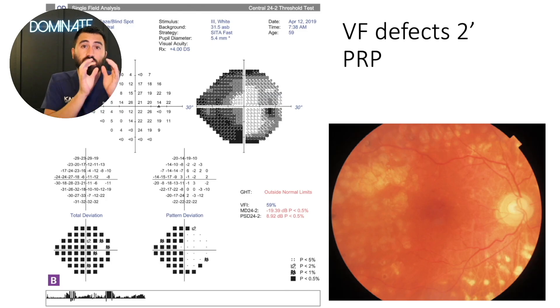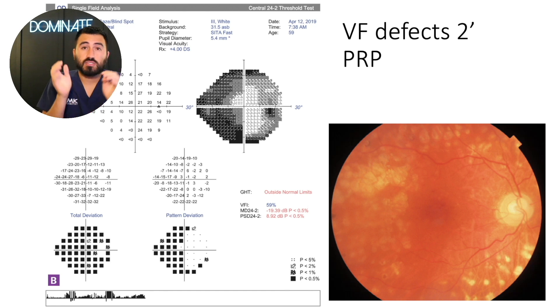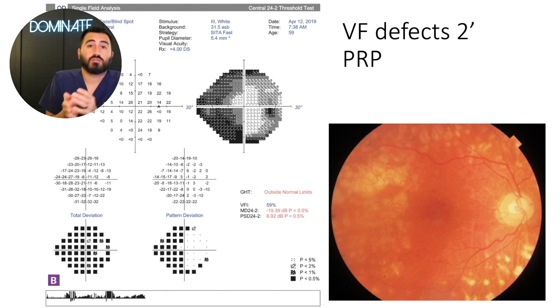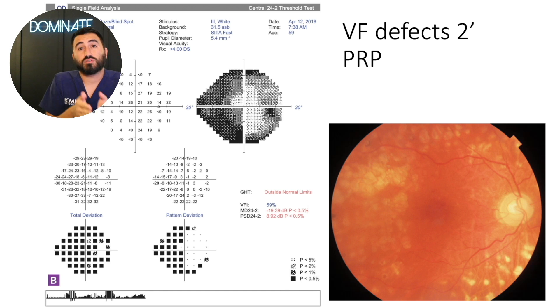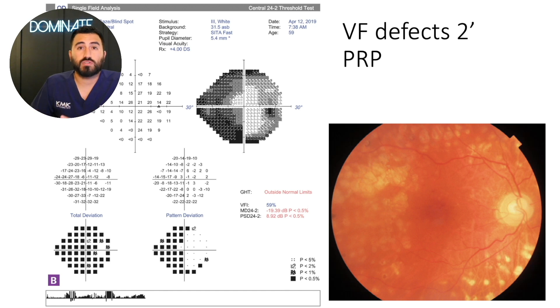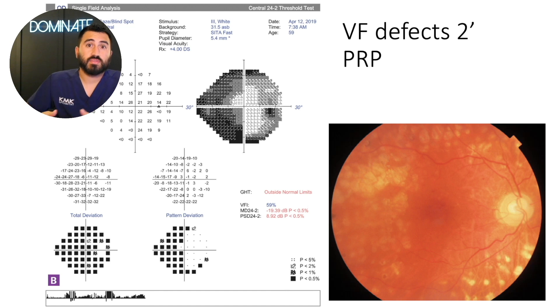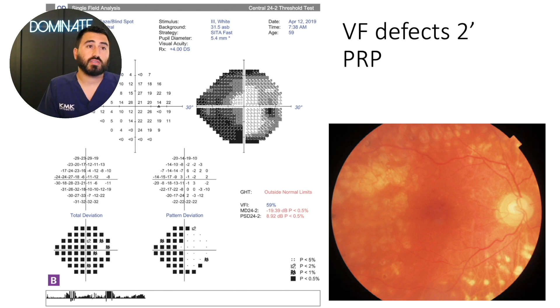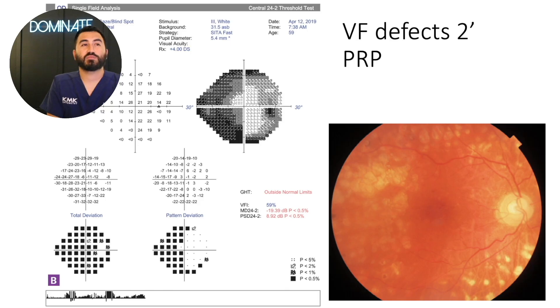Patients and doctors can misdiagnose glaucoma for PRP. A patient who gets PRP can have all of these defects, so it can be tough. If you have a patient who has PRP, you want to get a baseline visual field and then follow them to see if they're continuing to lose vision. Once PRP has taken place, the patient should not continue to lose vision — if there is progression, then that would be glaucoma. It's really easy to look at this picture and say, 'Yep, that's glaucoma, let's start treatment,' when actually, that's from the PRP.